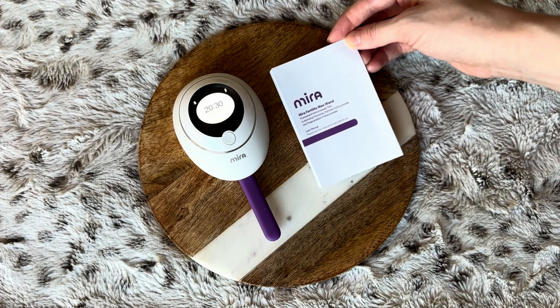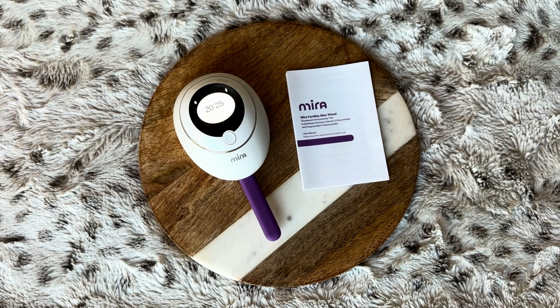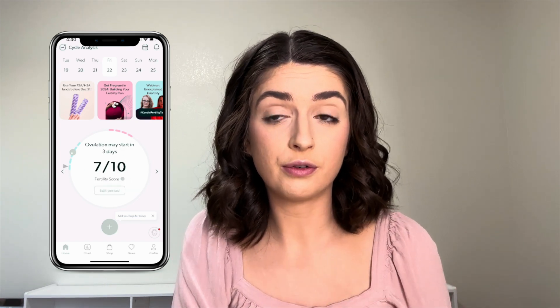Now that I've walked you through step-by-step how to use the Mira and the wands, let's check out the app and see what my results look like. When you download the Mira app, it will connect using Bluetooth to your Mira analyzer — that is how it shares the information from the analyzer to your phone. The app is free for Android and iPhone; you just search for it in your app store.